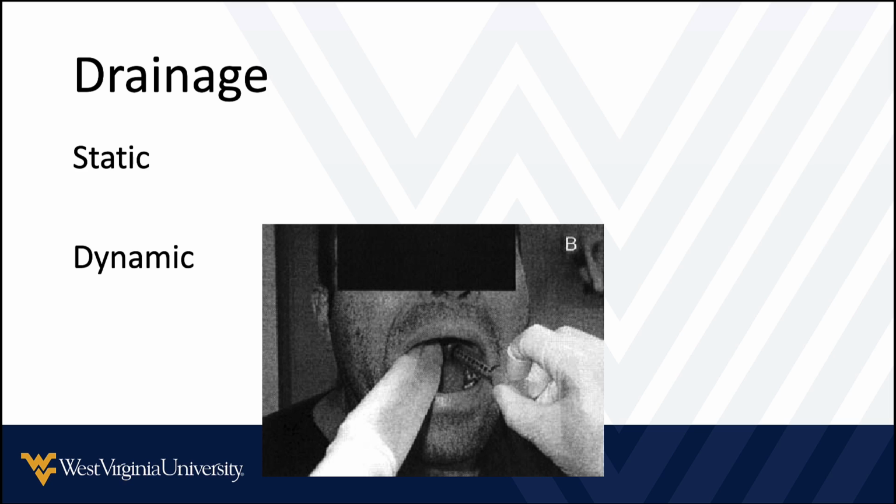Although I've just felt better and had better, quicker, more satisfying success most of the time when I do this dynamically. So that's what I do most of the time. But you certainly can do this statically. Once you've localized the abscess, just take note of your best placement where you saw the most depth and volume of that abscess, take note of that area, anesthetize it, and then get your needle in there.